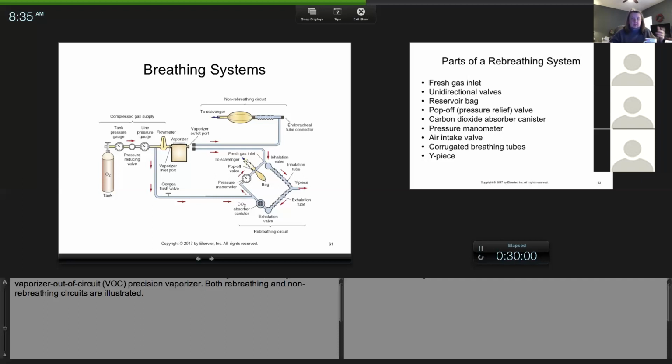And it's just going into the air that you're breathing. So I don't like that. It should be, at minimum, like at my old clinic back in Chicago, we had a pipe that went out the wall, and then the pipe went outside. So I'd hook it up there, and that's called a passive scavenge, where as the air blows, it pulls air. So on a windy day, it pulled more. On a not windy day, not so much.